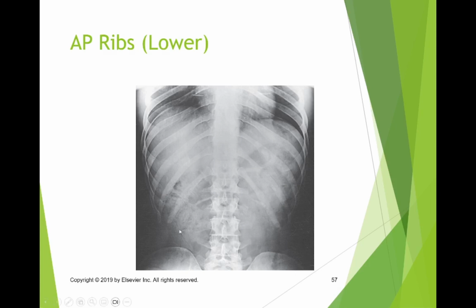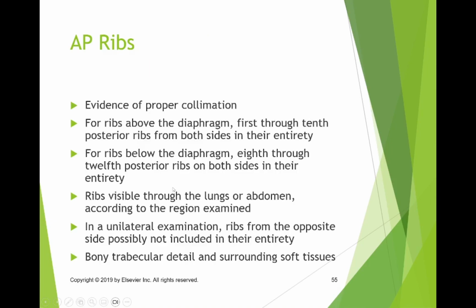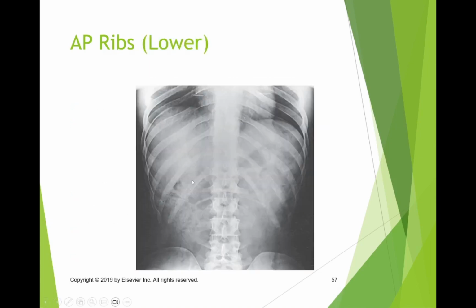If the diaphragm on the above is going right across, you don't see all of D10 here, or this 10th rib. But if we go back down here, we've got 12, 11, 10, probably not the same patient, but you can kind of get the point here. Between the two, you can see the entire rib.